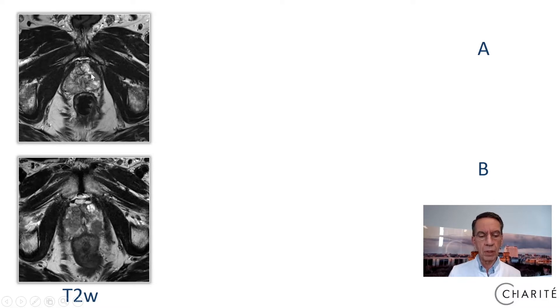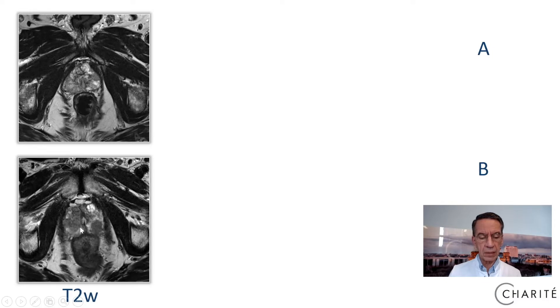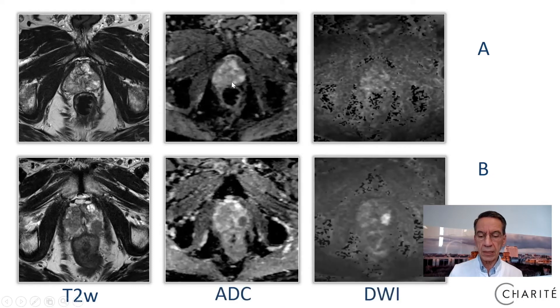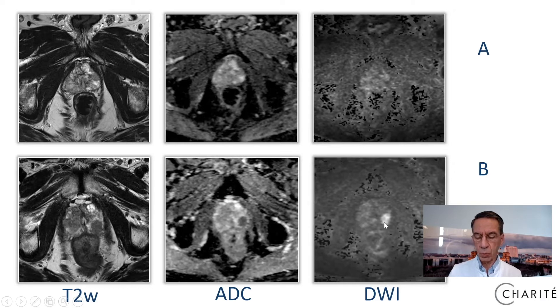In patient A, we see one lesion in the peripheral zone and some linear wedge-shaped changes in the peripheral zone on the right-hand side — looks like chronic prostatitis. Patient B has a focal lesion in the peripheral zone and another even bigger lesion on the right-hand side. Now let us add the diffusion-weighted imaging, the ADC, and the high B-value 1400. This lesion has some diffusion restriction on ADC and high B-value, and this lesion has an even more significant diffusion restriction — the so-called black and white pattern.